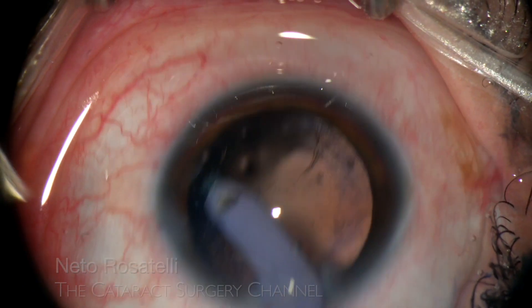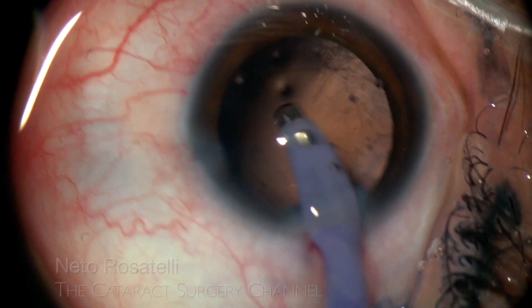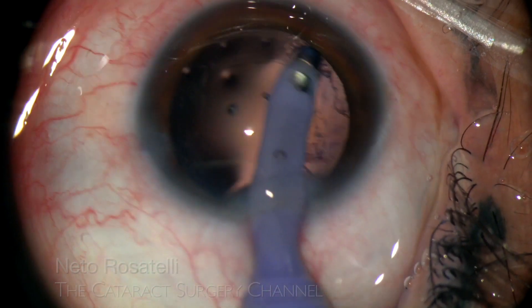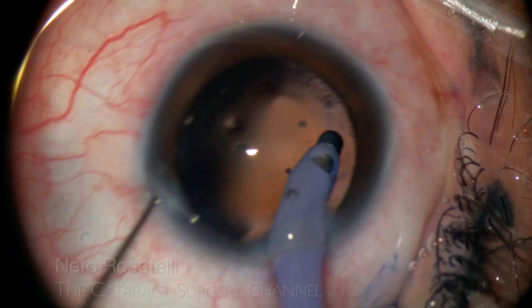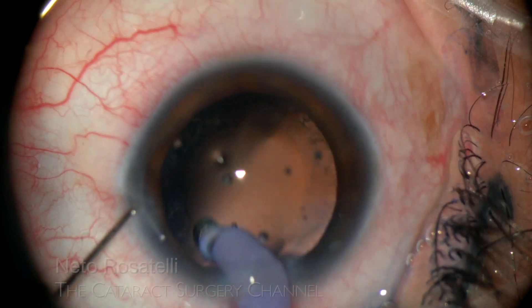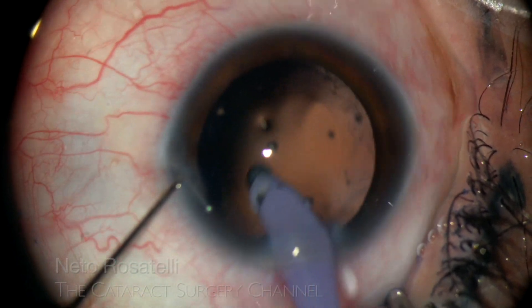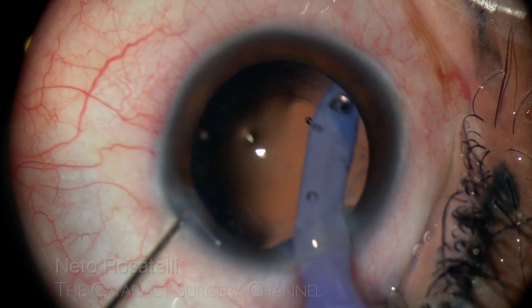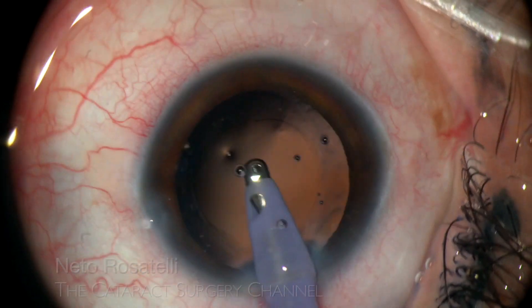Posterior capsule polishing must be carefully and patiently performed, especially in the central zone, to avoid the need of early YAG laser capsulotomy. The chopper can help in stabilizing the eye in difficult to reach positions. Thin, stringy cortex remnants outside the central zone are of no consequence if left behind — no need to risk rupturing the capsule.